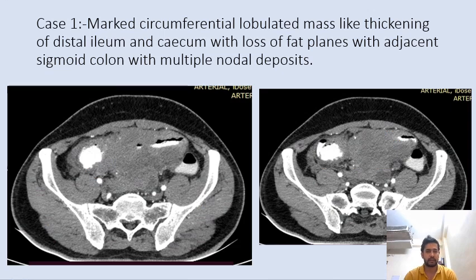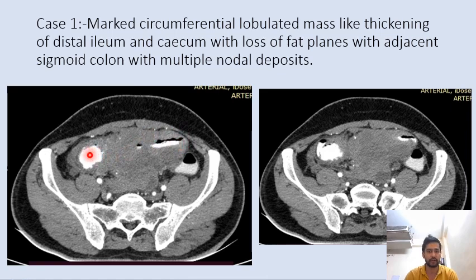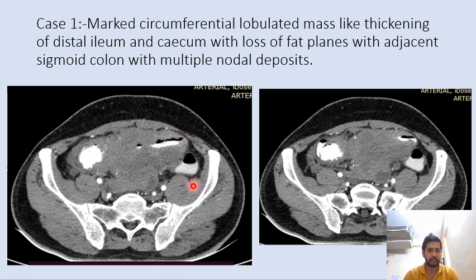In case one, we can see marked circumferential, lobulated mass-like thickening of the distal ileum. We can still see the lumen with contrast passing through, so no intestinal obstruction has occurred even at this advanced stage. We can also see nodal deposits here.